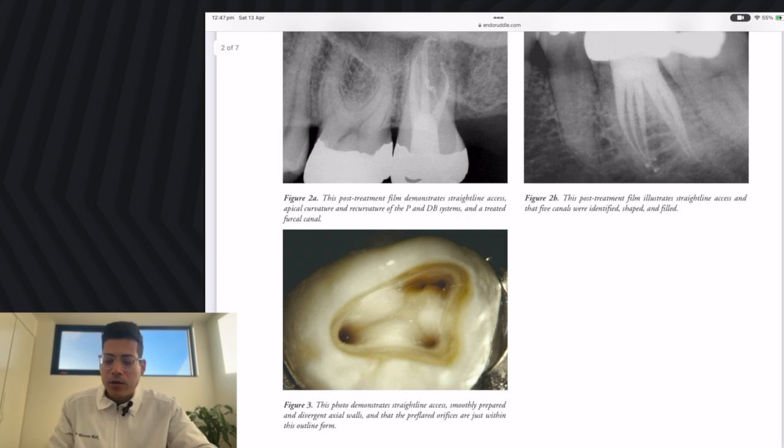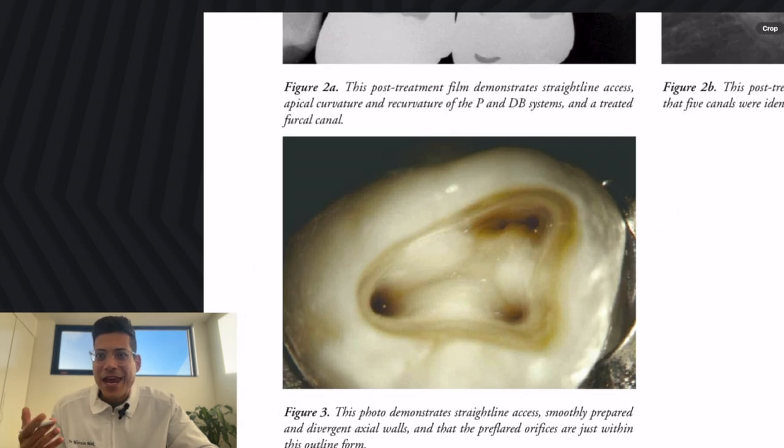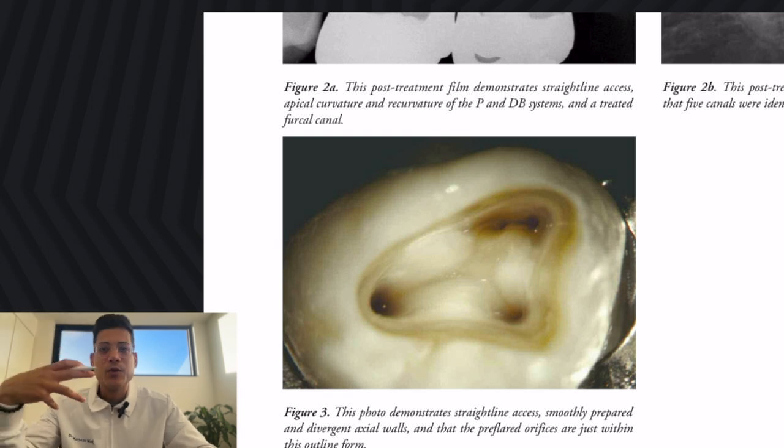Now, when I look at something like this, I feel like dentists who are doing the exam get really scared. It feels like, oh, they've opened the cavity so much. But if we actually look at the grading criteria, sometimes opening more works better for you. Because what happens with endo? What is the biggest worry when you do an endo task? Leaving any roof fails you.